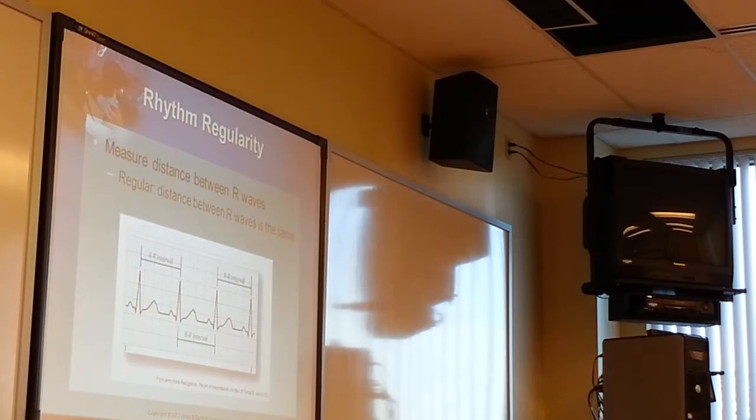I'm dating myself. We used, I don't want to say calipers, but is it calipers? We used calipers to measure, to march them out, to see if they marched out correctly. The distance between R and R waves is always the same.